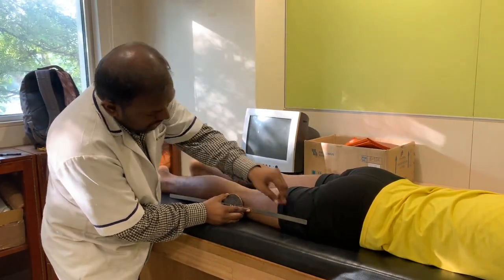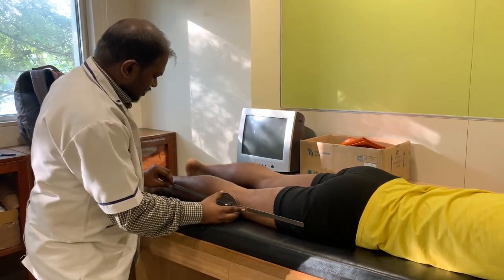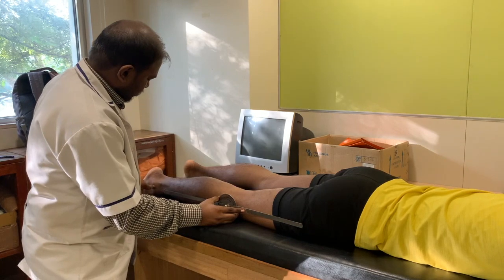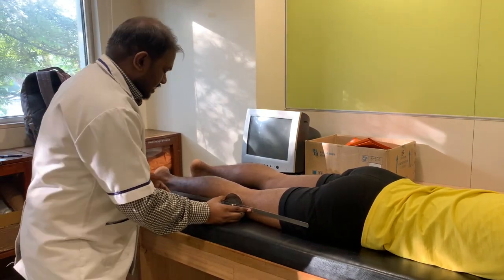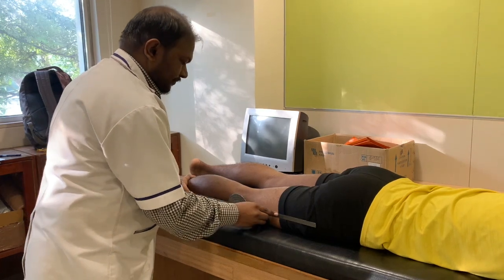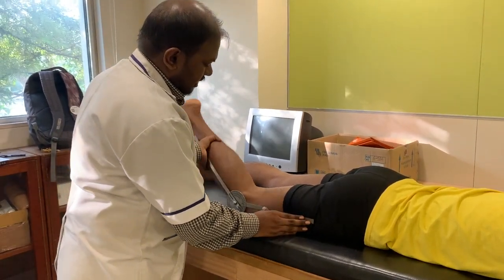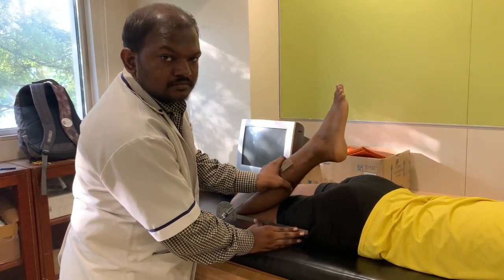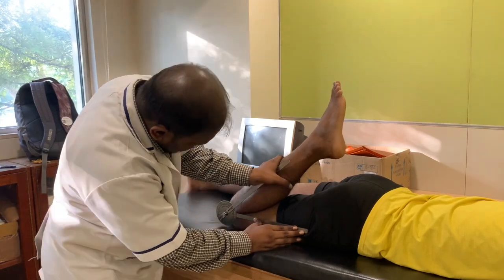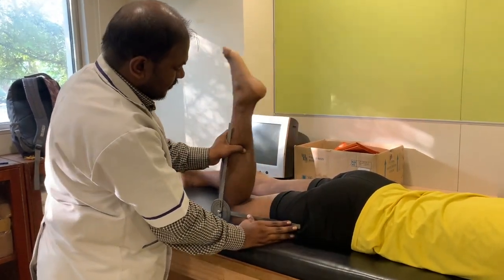The stabilizing arm should point towards the greater trochanter, and the movable arm will point towards the lateral malleolus. Again you will hold and take it into knee flexion. So here again you get 130 degrees of knee flexion.